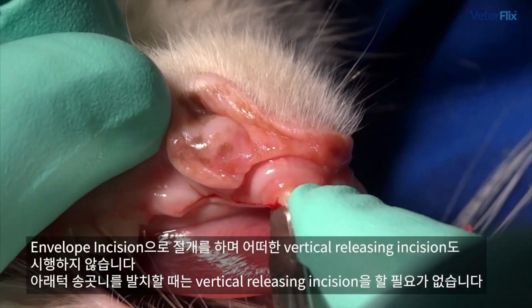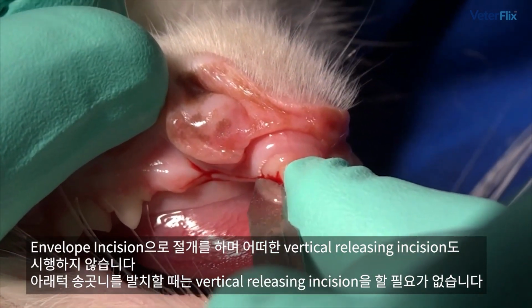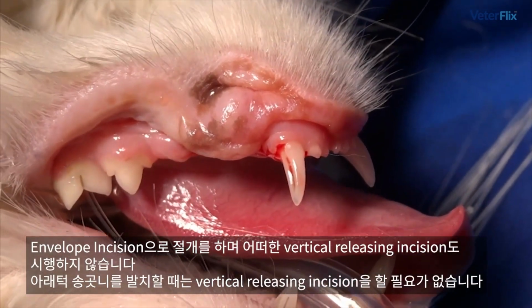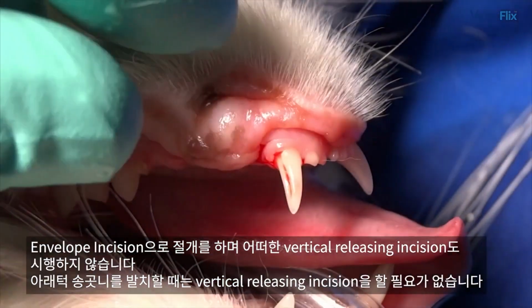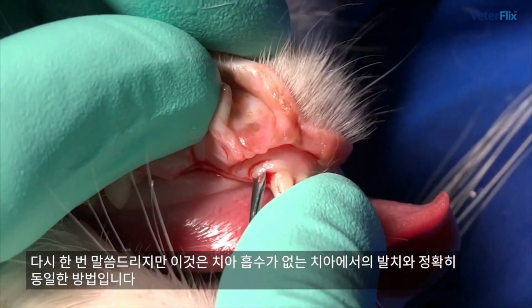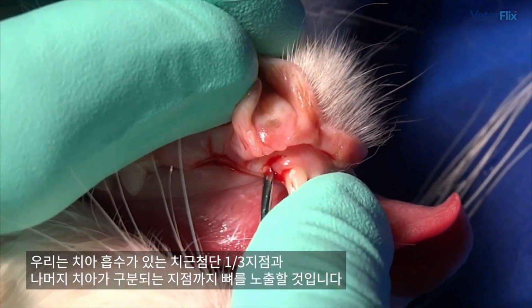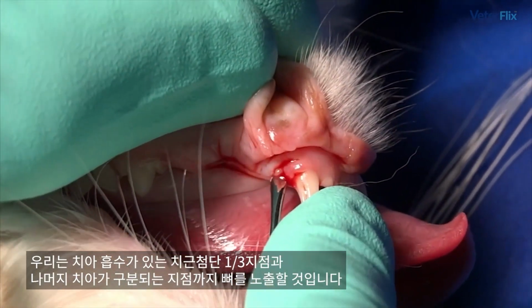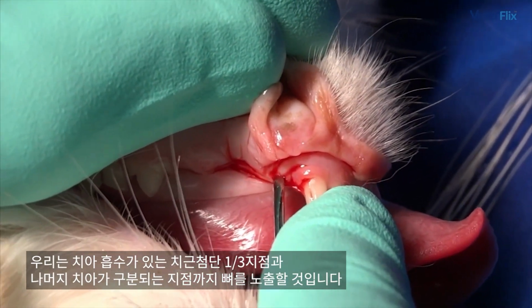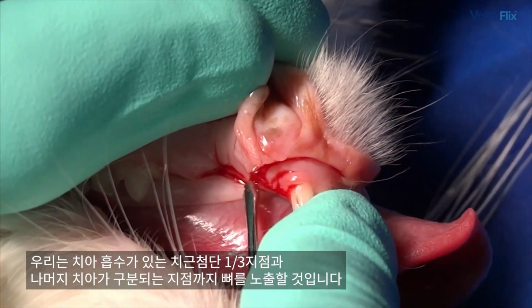As we're progressing through here, we've made an envelope incision. We're not going to be doing any vertical releasing incisions here. We don't need to do that to extract the mandibular canine tooth. And again, this is exactly the same approach as we would take if this were not a tooth with tooth resorption. We want to be able to expose the bone. We want to get down to where you saw that differentiation between the tooth resorption portion of that apical 1/3 and the rest of the tooth.